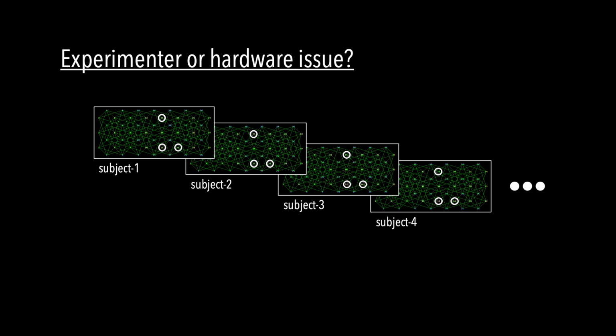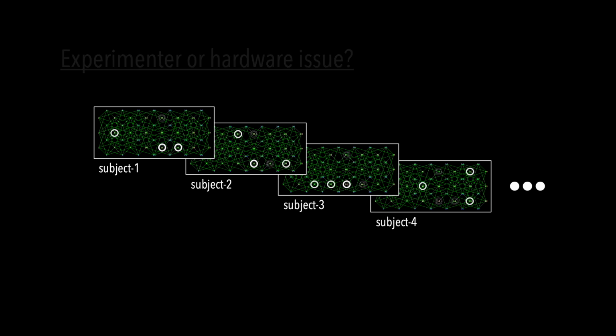For example, if the QA analysis consistently flags the same optodes or the same array region across multiple subjects, it may indicate faulty hardware or a systematic error in array placement. These issues should be investigated and addressed before data collection proceeds. Parenthetically, a varied distribution of flagged optodes is preferable, as not only does this argue against a hardware issue or experimenter error, but it is less likely poor coverage in the individual subject maps will be an issue once they are combined in a group analysis.